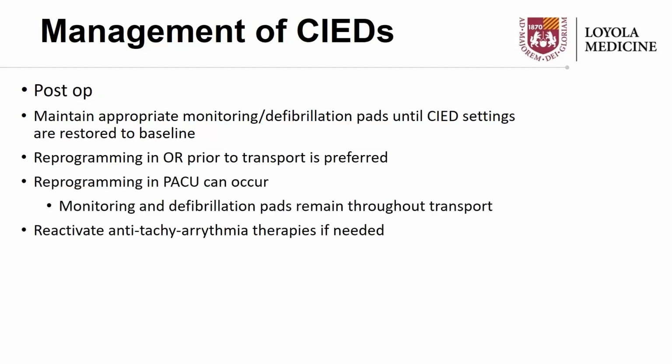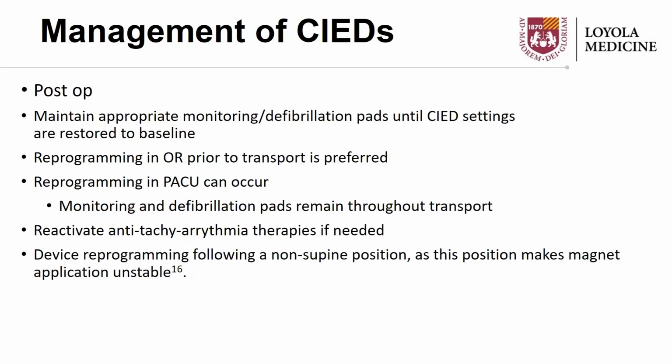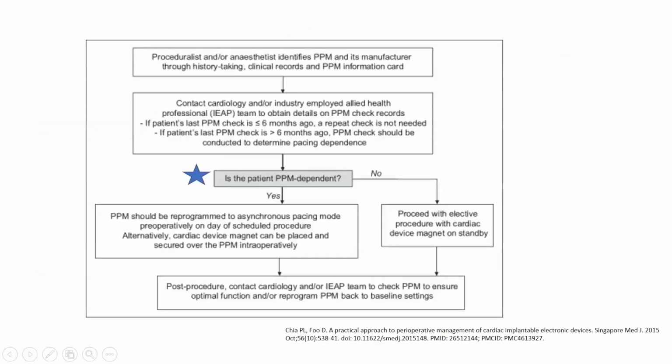However, you have to keep in mind that cardiac monitoring and the pads should remain in place until reactivation of the ICD if the patient has one. It's also important to reactivate any anti-tachycardia arrhythmia therapy. Sometimes this can be forgotten, so important to activate them after the procedure. And this literature review also stated that in a non-supine position, it's also important to note that the device may be unstable, and reprogramming is also recommended for that as well.